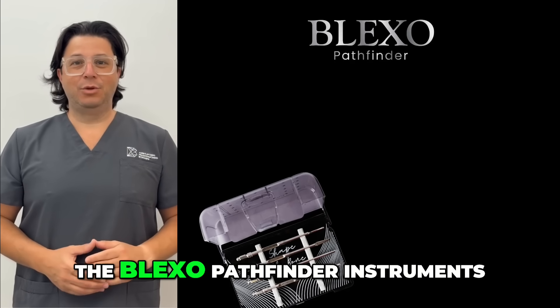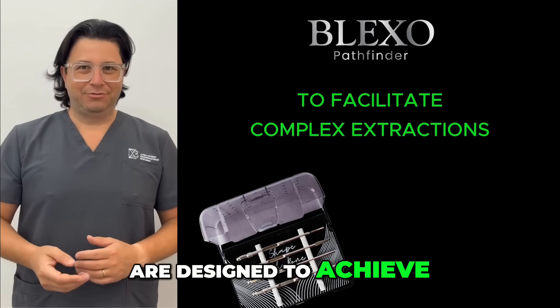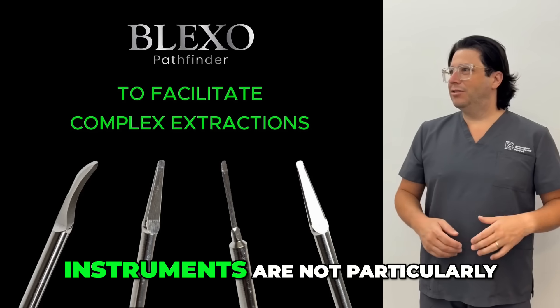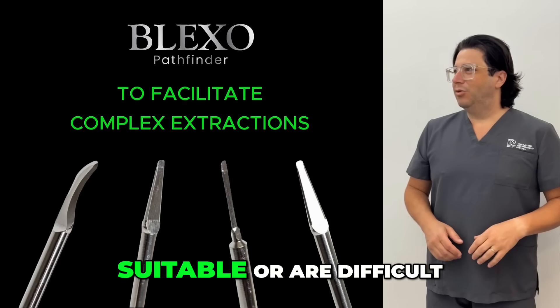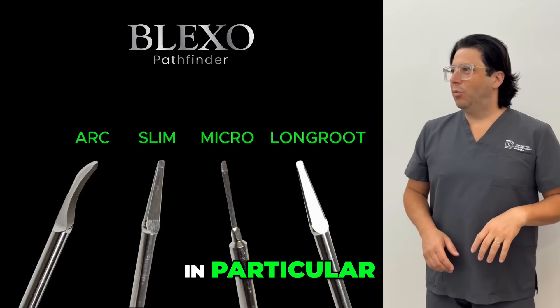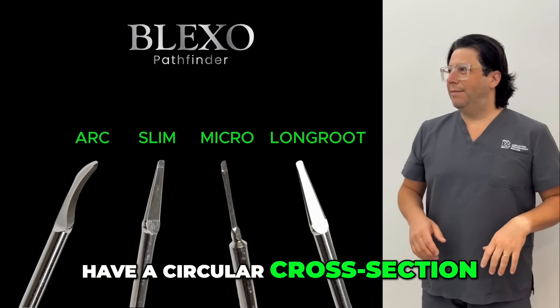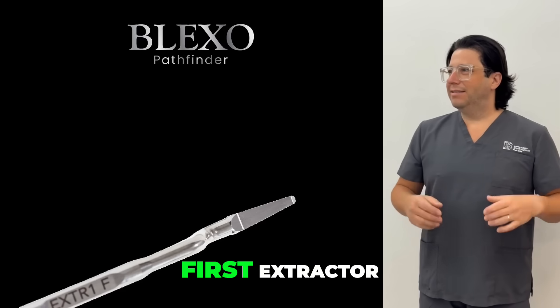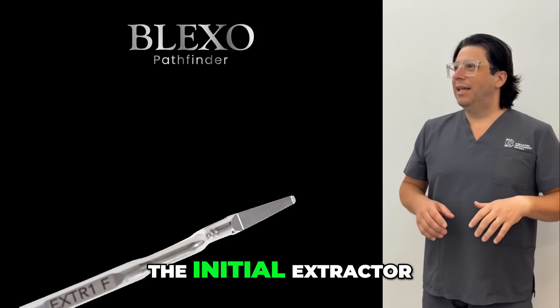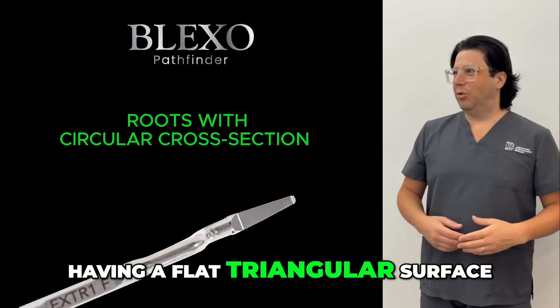The BLEXO Pathfinder instruments are designed to achieve effective periodotomy in all those situations where traditional instruments are not particularly suitable or are difficult to use. In particular, when faced with roots that have a circular cross-section, the use of the first extractor — commonly used as the initial extractor — presents the problem of having a flat triangular surface.